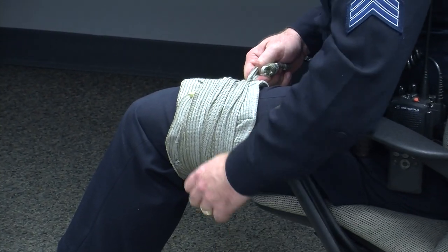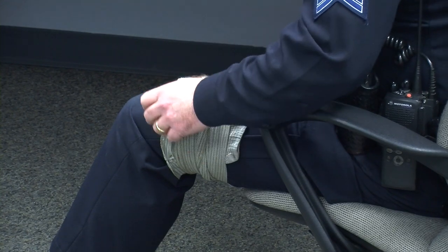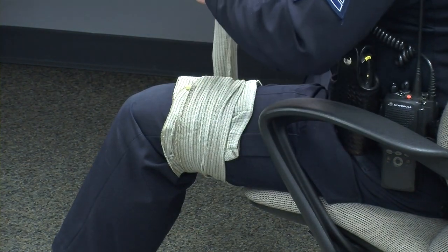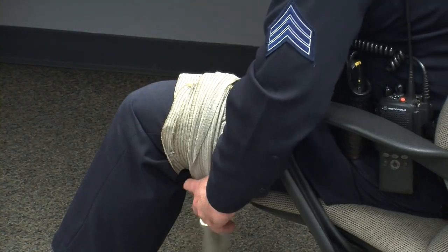And these things can be used on arms, legs, head, neck. If you're doing a head or even an ankle and you want to change direction, when you loop around the next time, swing it around that pressure bar, and now you can go the opposite direction. They work very, very well.